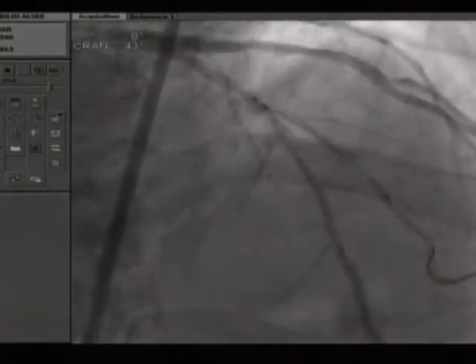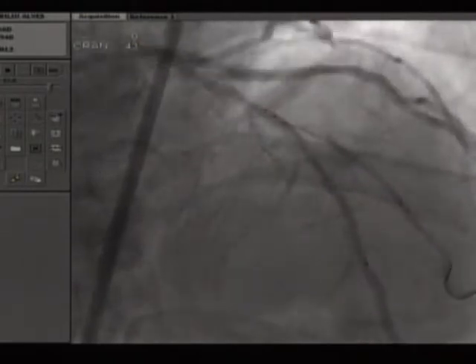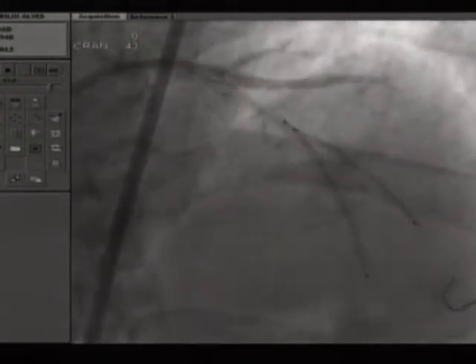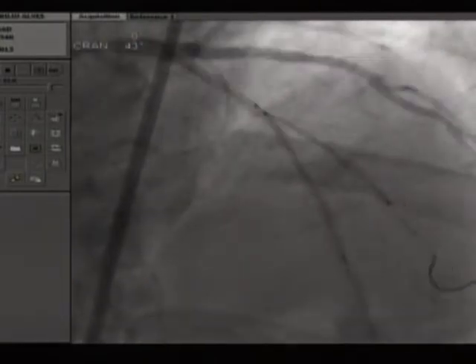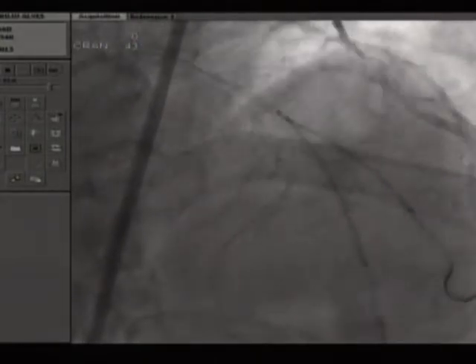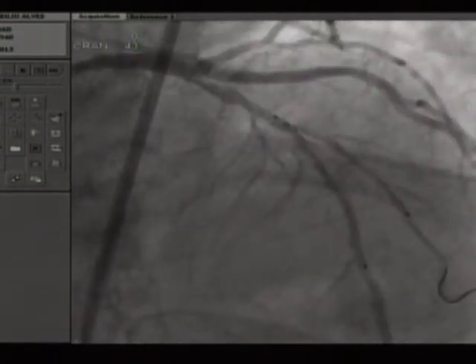I don't see many struts or a long crush. But it's interesting that most people in this situation use mini crush, even though there's not good proof for it. You can also use culotte in this situation. People at least tend to go away a little bit from it because it's probably a little more complex. Yeah. And this is an easy way to get out of a problem. I think it's very well done.